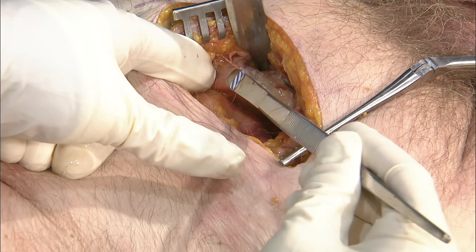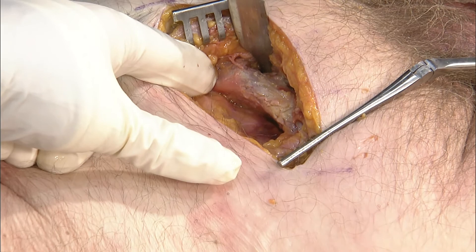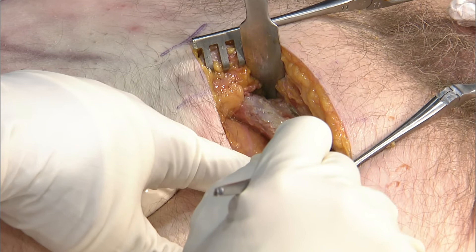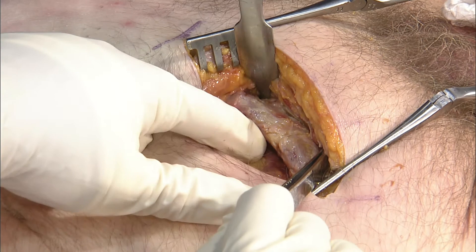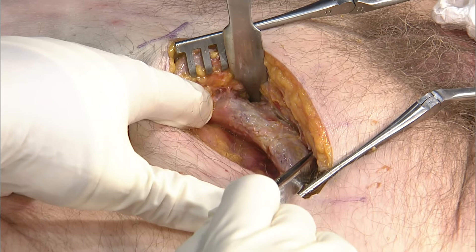You'll notice that as you get off of your pubic body, there is a dramatic fall-off in height, and that's going to change your plate placement — you'll need to bend the plate accordingly. For plate fixation, for an APC2-type injury I'll typically use a four-hole plate, but for an APC3 I want more stability and may go to a six-hole plate, or for various other reasons. Discuss this with your table instructors to understand their thought patterns for the different plate choices.